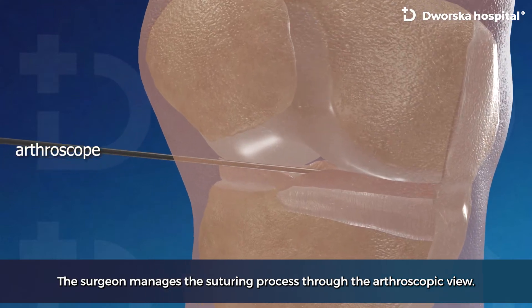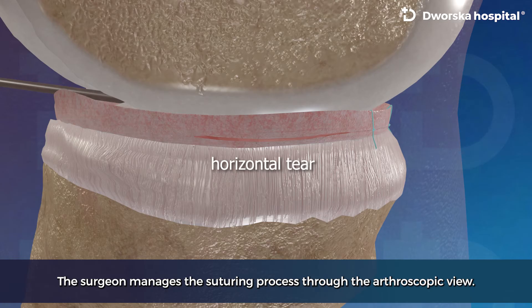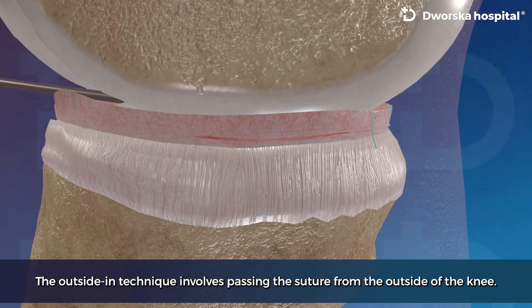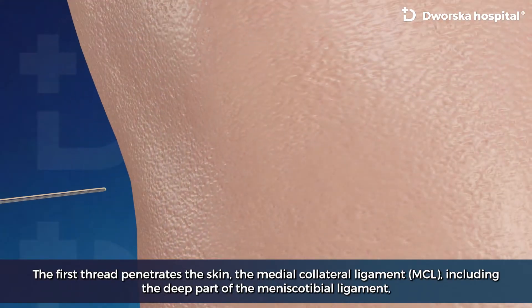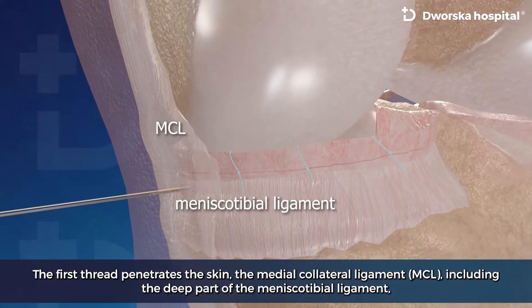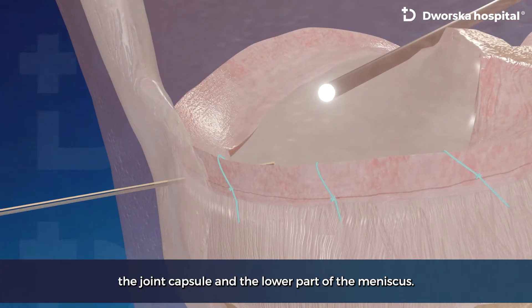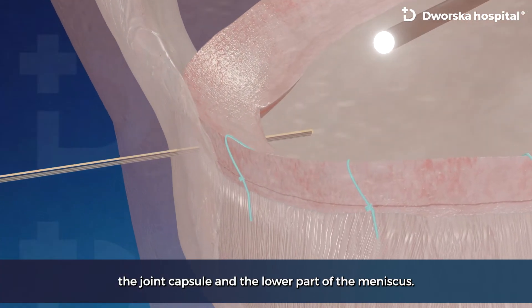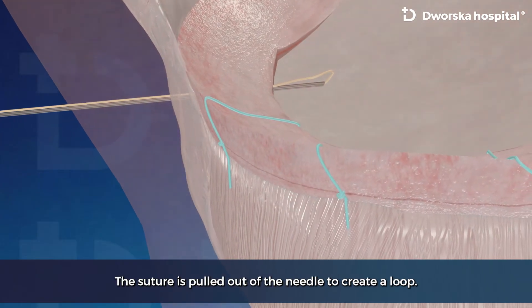The surgeon manages the suturing process through the arthroscopic view. The outside-in technique involves passing the suture from the outside of the knee. The first thread penetrates the skin, the medial collateral ligament including the deep part of the meniscotibial ligament, the joint capsule and the lower part of the meniscus. The suture is pulled out of the needle to create a loop.